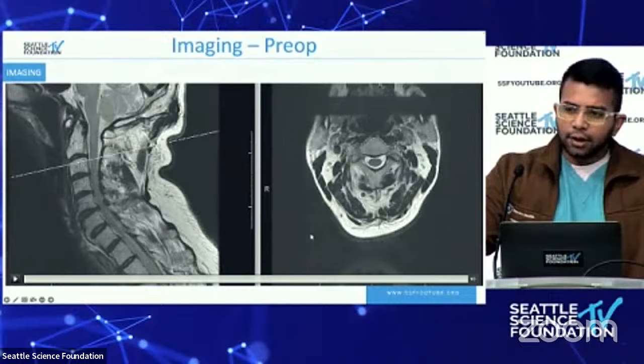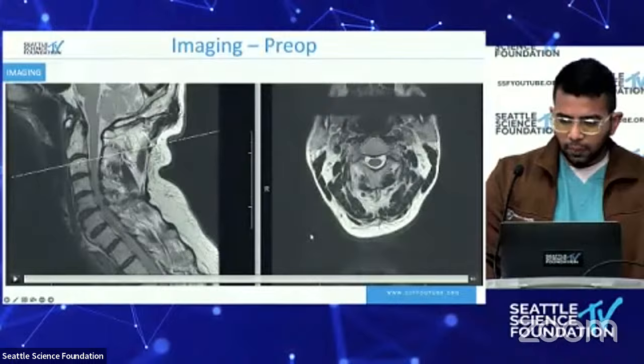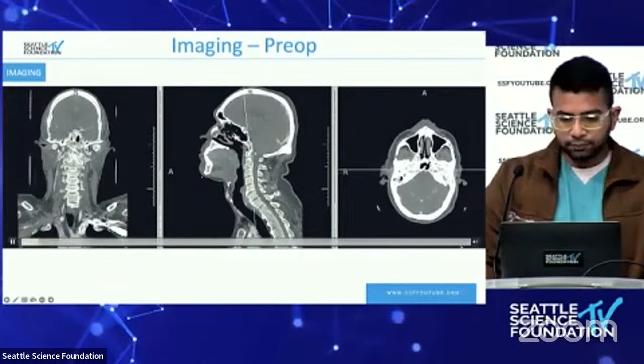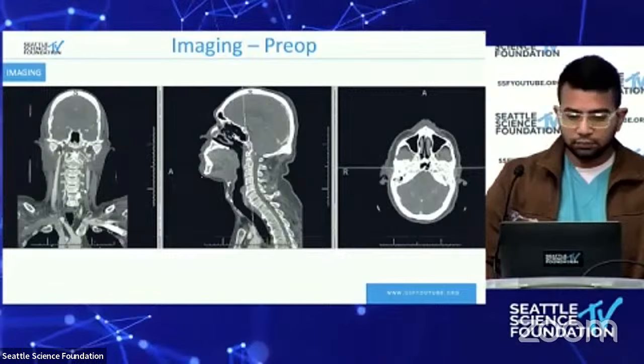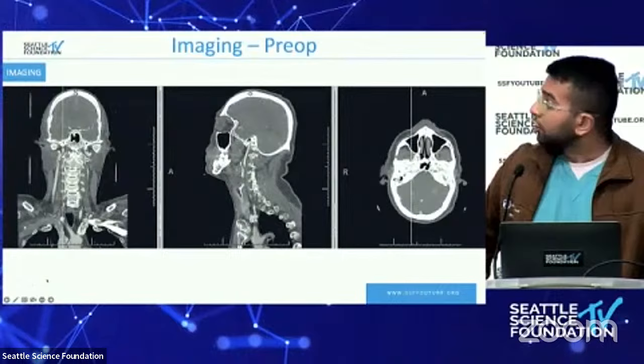So now to the main topic at hand. This gentleman has subaxial stenosis and he has a hangman's fracture. We should probably, Neil, switch back to the CT scan. Yep. If you have the coronal reformats. And so there's spondylosis, stenosis, and now there's something else going on. Whenever fractures enter the transverse foramina, we nowadays get what, Neil? CT angiogram, which we did, and here it is. So what is here?